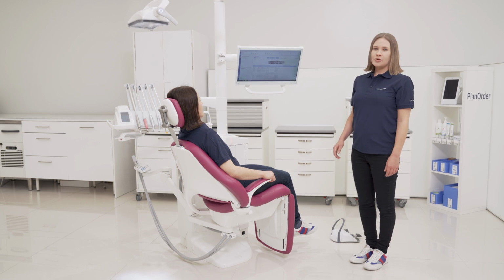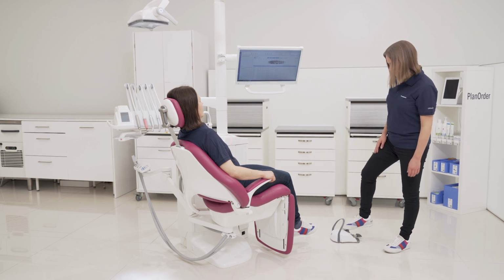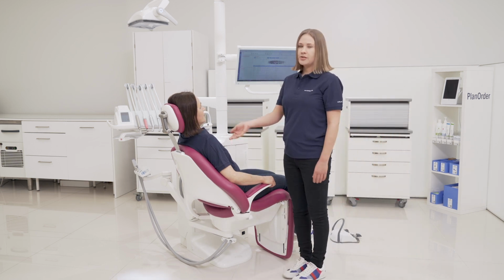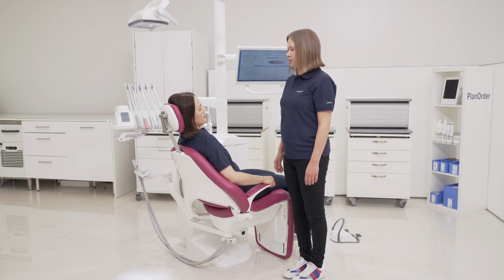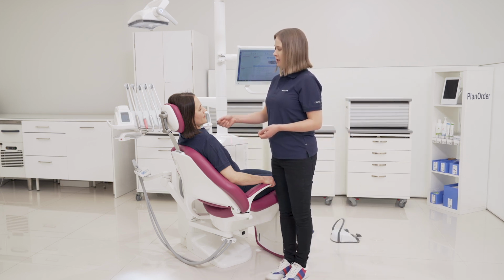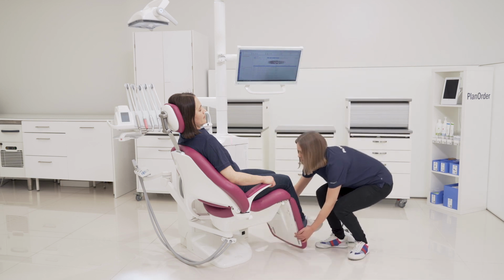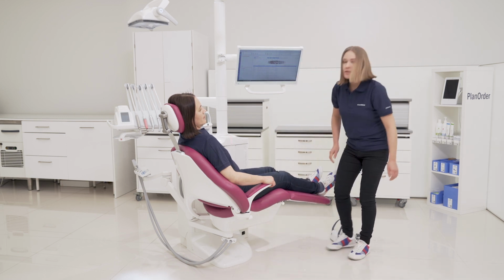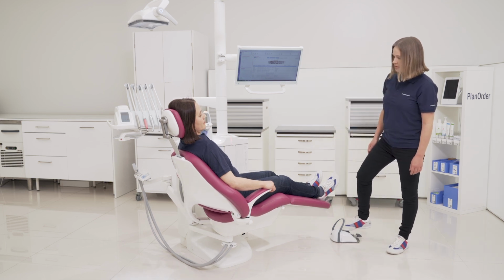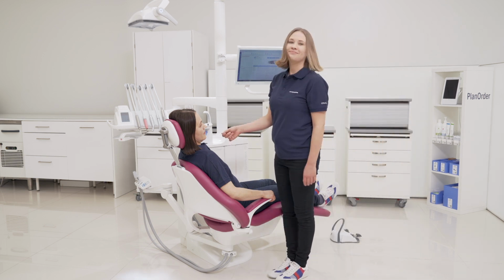There is also another thing I would like to mention about the automatic leg rest. There are some situations where you would like to get the chair as low as possible. For example, if you are treating the patient in this kind of upright position. If you're not that tall yourself, you would like to get it even lower. So in those situations, you can just lift the leg rest and then you can get the chair a lot lower, like this.